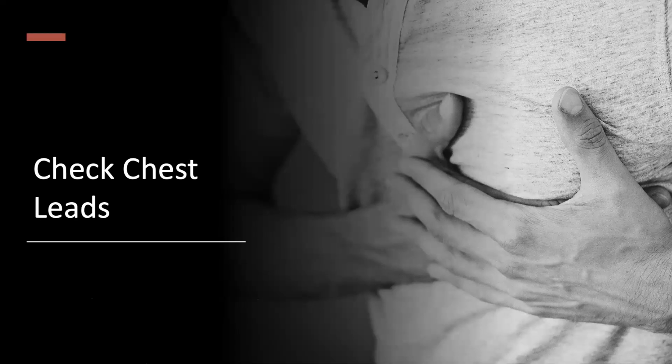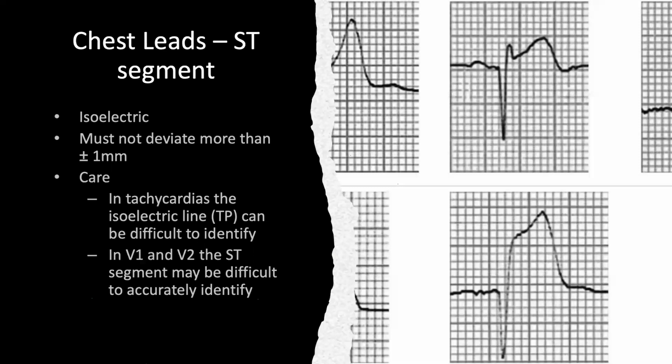The next thing really is thinking about your chest leads. So again, that ST segment that you'll learn to love or hate. And there's lots of causes of ST elevation. They're not all MIs, and they can do wonky things. But as you can see with this ECG here, on the right hand side, you've got that big ST elevation. If it's more than 1 millimeter in that lead and it's across multiple leads, thinking about your STEMI, so your ST elevation MI, and wanting to get that patient to the gold standard treatment, which is PCI.